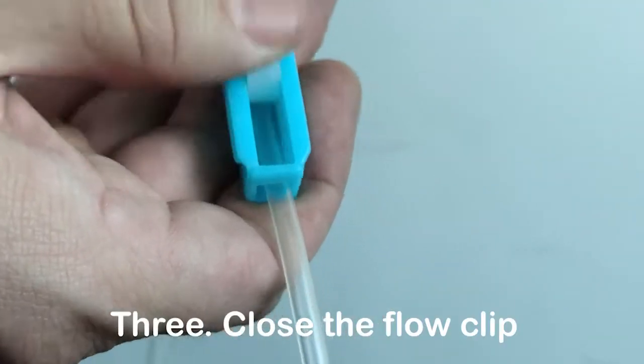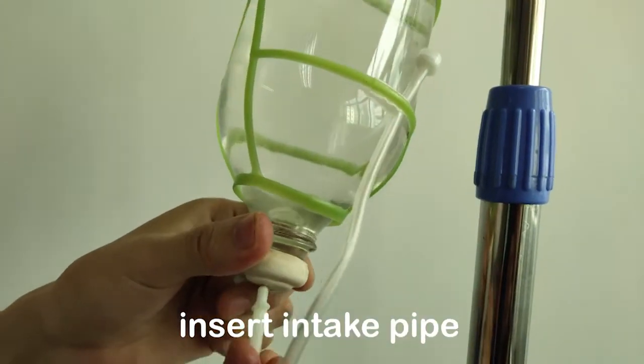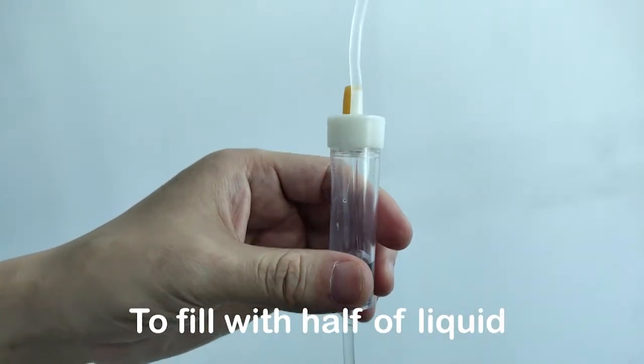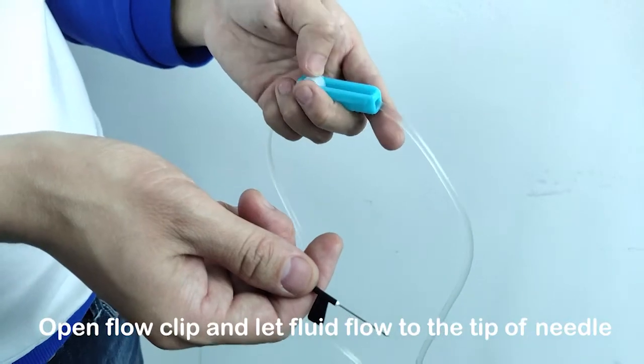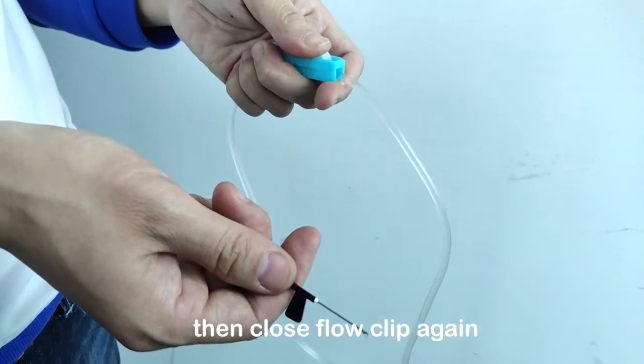Step 3: Close the flow clip. Connect the IV set to the fluid bottle and insert the intake pipe. Squeeze the drip chamber to fill it halfway with liquid. Open the flow clip and let fluid flow to the tip of the needle, then close the flow clip again.